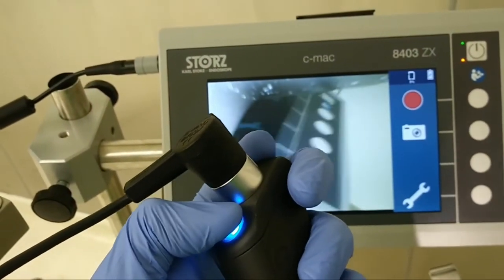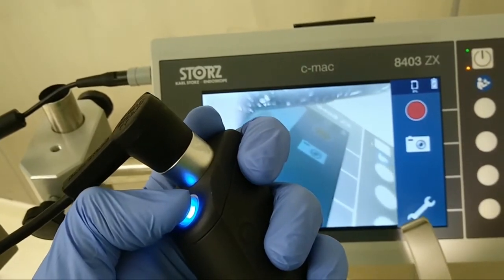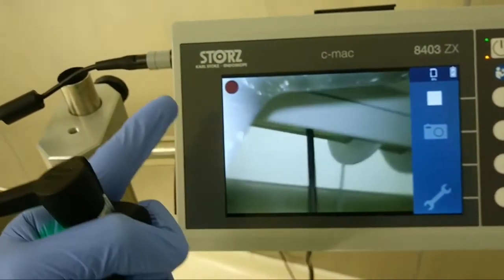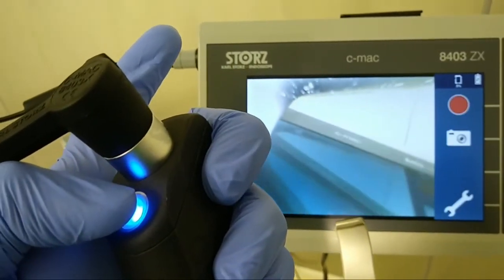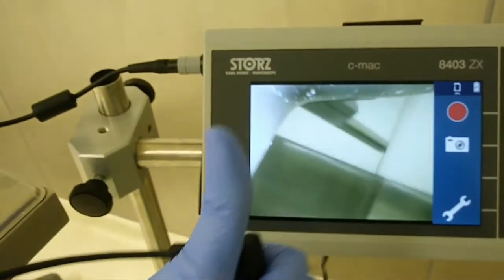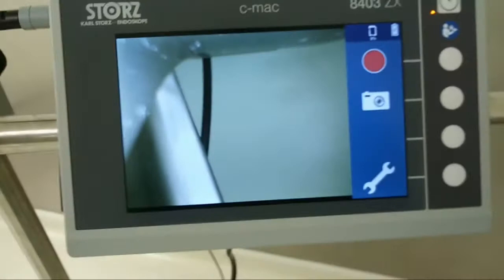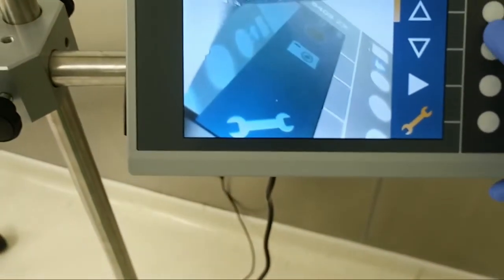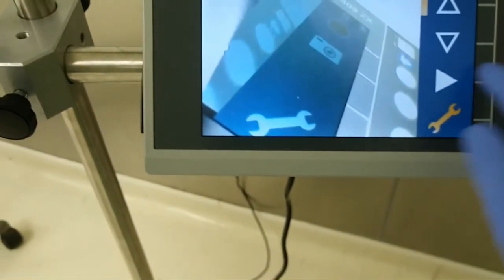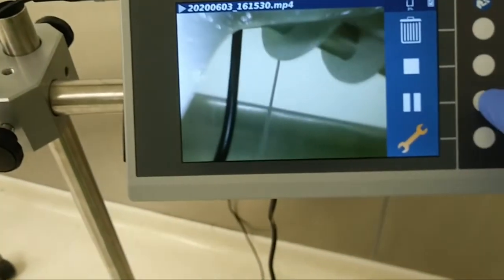We can see whether our memory status is full or less. If the memory card is full, we can transfer the photos and videos and all data through a pen drive or other devices, and we can empty the memory card and reuse it. In settings, we can open this much capture. This is how to view the old pictures and videos.